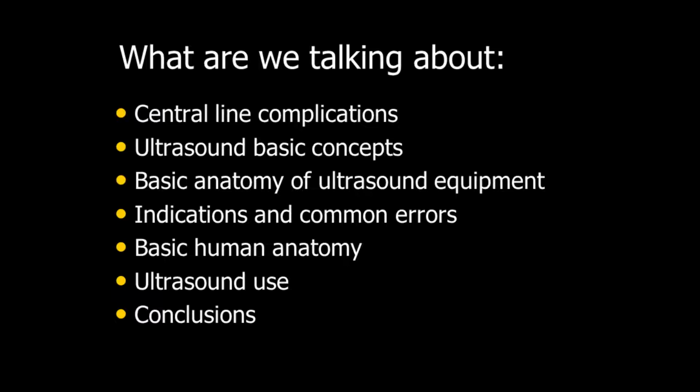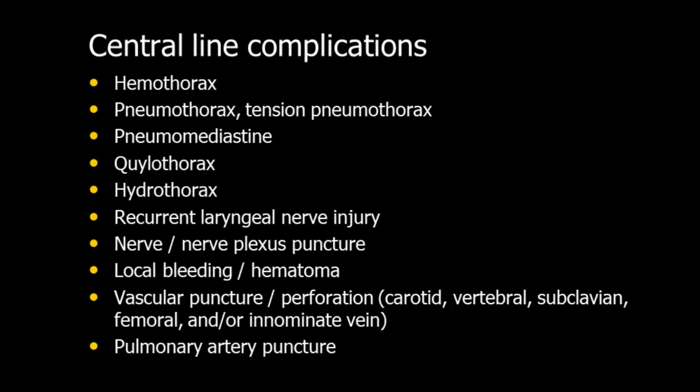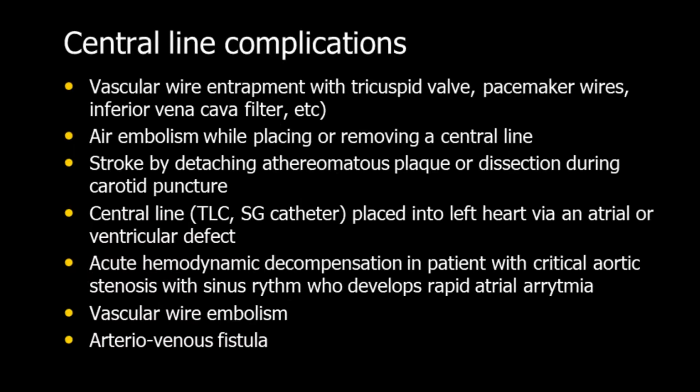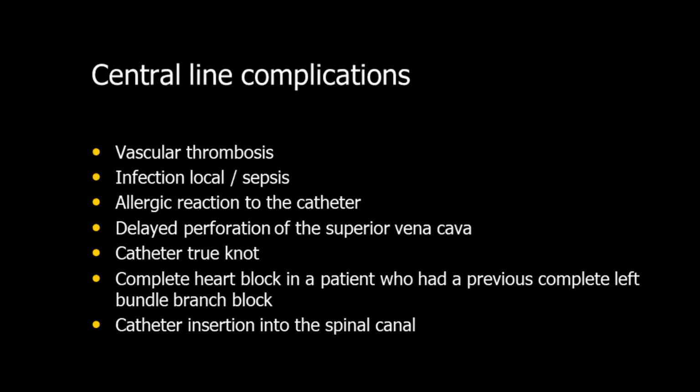On complications, there are many. I created a list of many of them, and it'll be interesting to just stop and read all of them. Some, like pulmonary artery puncture, I'll show a case of that. Others, like cardiac tamponade, are a very important complication. But take a look at the list and just read them all. I'm sure I missed some, but all of these have been reported in the past.